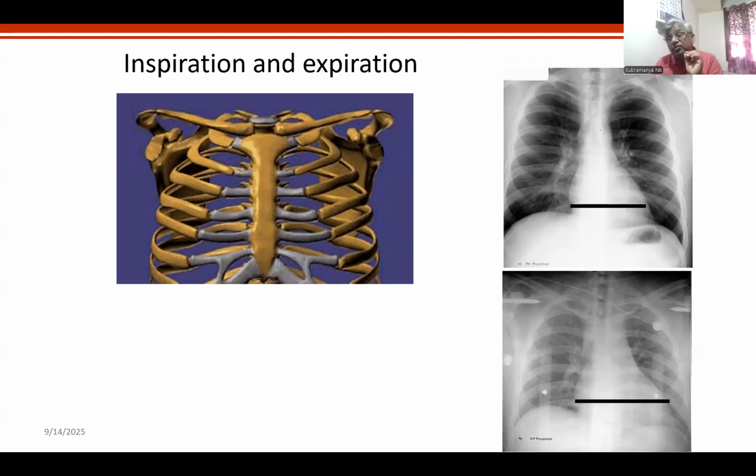or not. And you should get acclimatized to interpreting an expiratory film in such a way that you know the limitations and then interpret an expiratory film. Because you can't go on ordering too many films. And let me also tell you, in a child with respiratory distress, the expiration is often prolonged in viral infections. In viral infections, does the child inspire well? There is air trapping. Did you understand? By default it comes to a phase of expiration because expiration is also prolonged compared to inspiration. Most often than not, you end up clicking the expiratory phase of respiration.